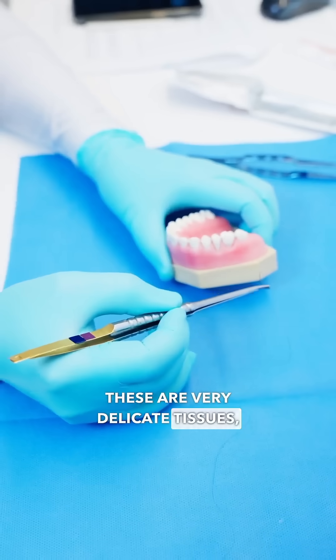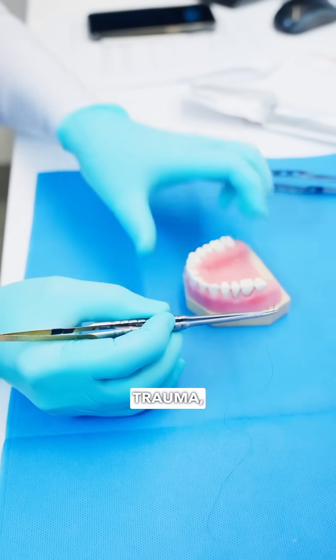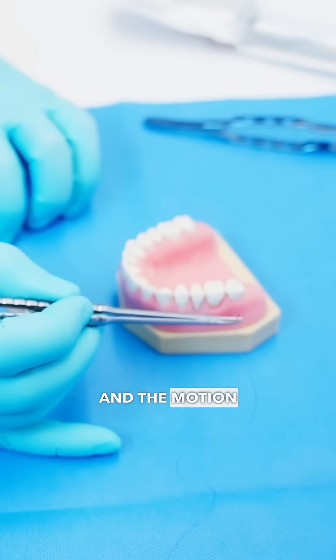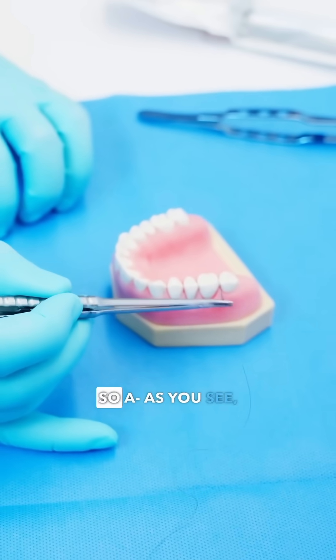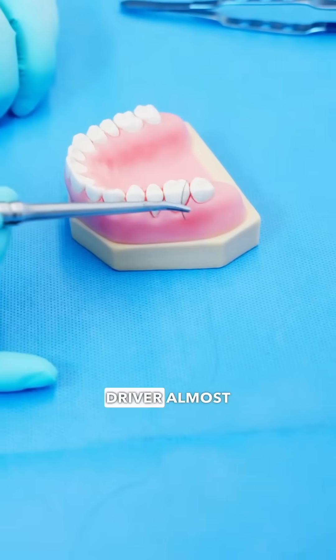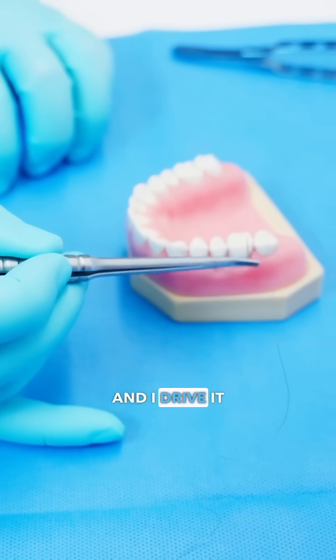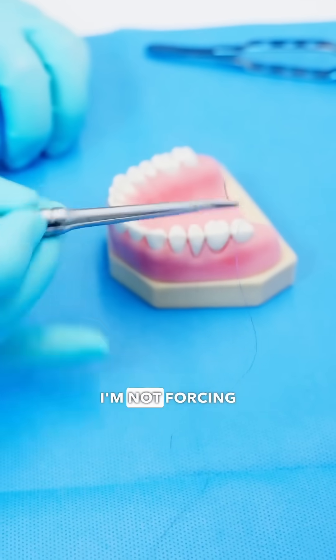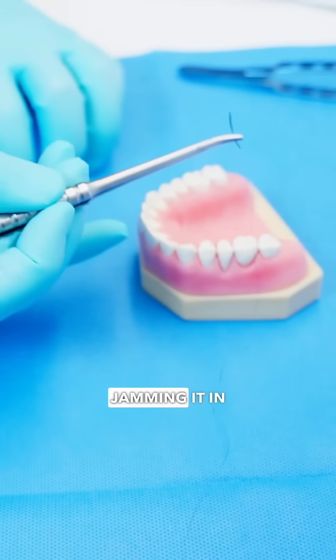These are very delicate tissues, so in order to cause minimal trauma, we use these microsurgical instruments. The motion is very gentle — I'm using this driver almost like a pen and I drive it in just by turning the needle driver. I'm not forcing anything in or jamming it in there.